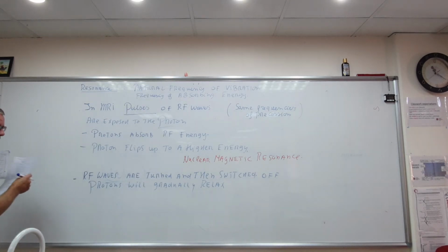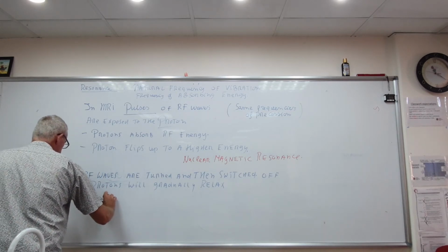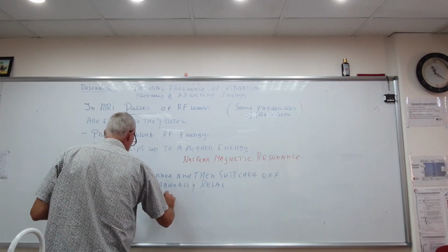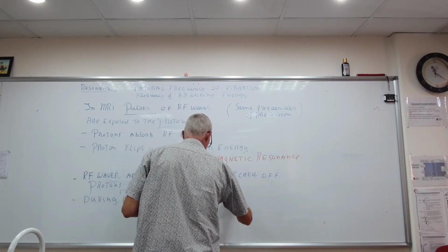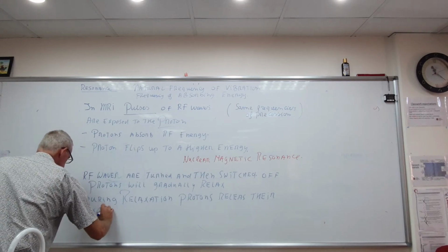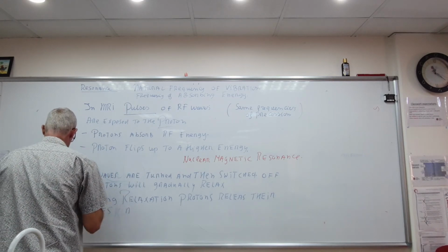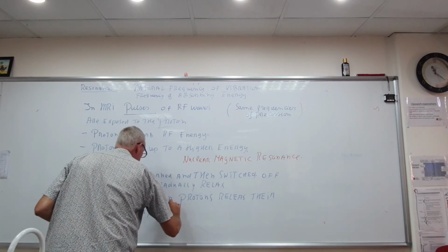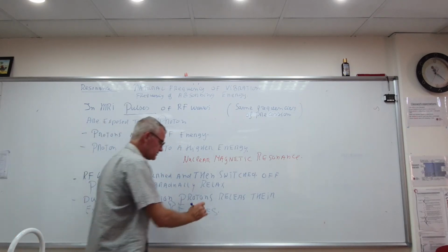During this relaxation process, they release energy. So, during relaxation, protons release their excess energy in RF waves. Yeah? These waves, they are detected.